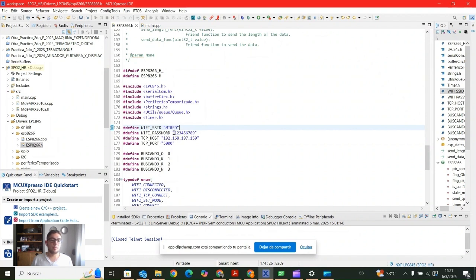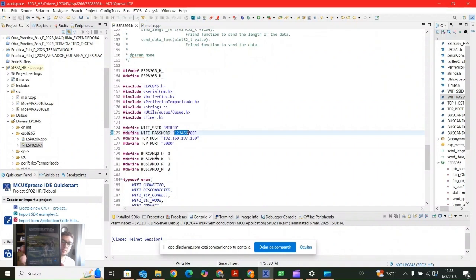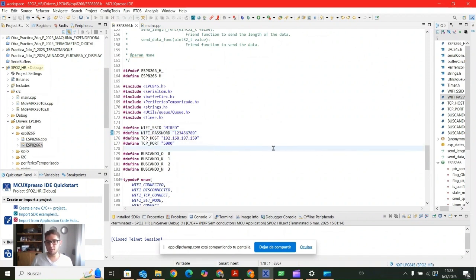Then we are going to load the password that we previously chose in our cell phone. Another important line is the TCP host. This is an IPv4 direction, and the TCP port. So previously in our phone, in the mobile hotspot option, we can see the name of the network and the password previously configured. We are going to copy these things into the code, and we are going to connect to the phone. We are going to establish the connection.